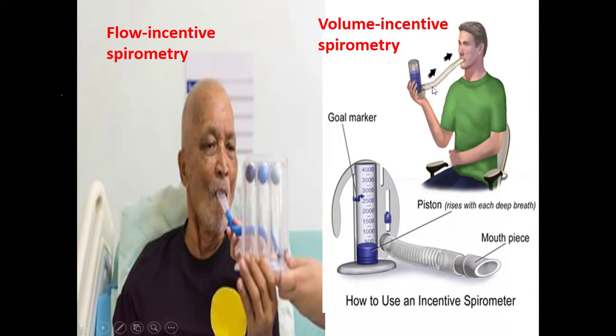The other one is using the goal marker, so it can be following these goals and the marked volumes.